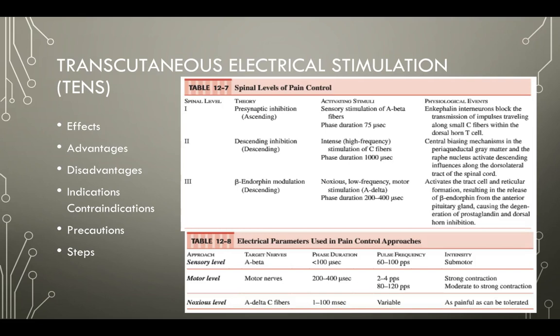Again, with that, we can get some other side effects, potentially some edema reduction, potentially, again, the decreased muscle spasms and things like that, but they're all secondary to the pain relief, so that becomes the main indication.